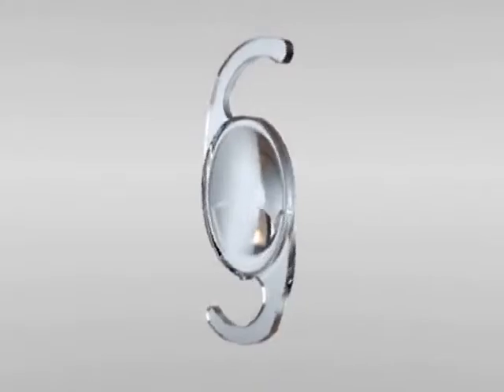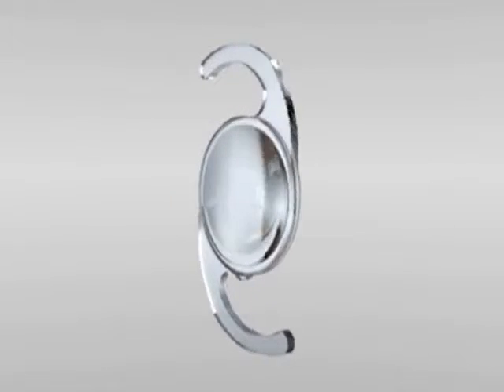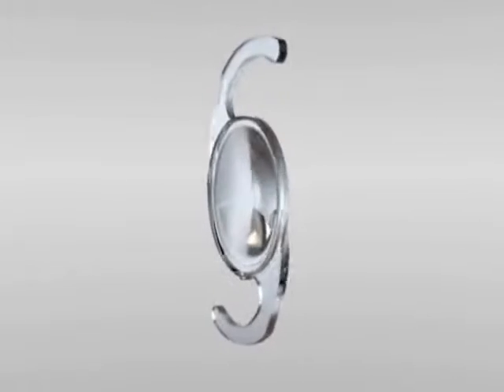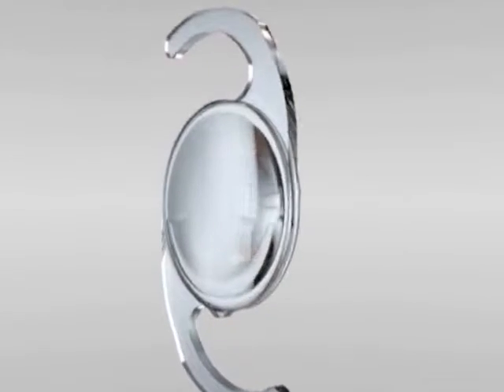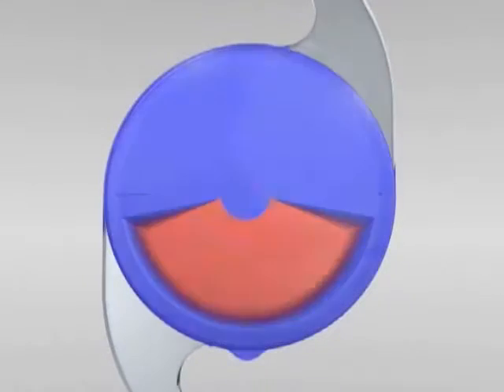And this is the new concept comprised in a new lens. In this lens we have a sector that focuses the light for near only. The specific improvements in the optical geometry of this lens are that most of the lens is for far with an area for near. The lens is semi-meridional, divided into optical sectors, creating a truly pupil-independent intraocular lens.